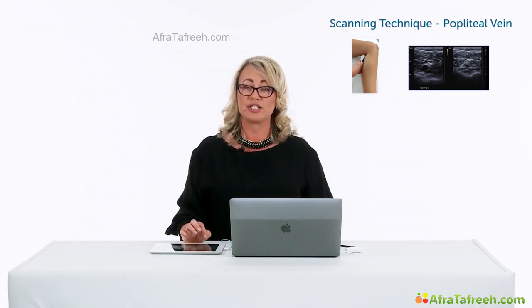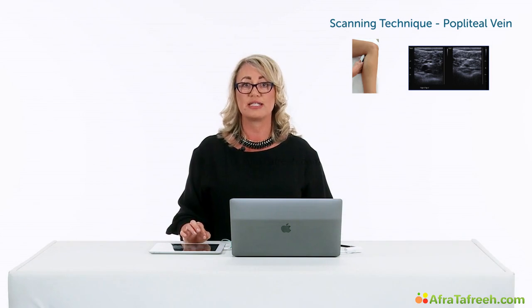You can slide back to the knee crease then and continue compressing the popliteal vein caudally until it divides into the tibio-peroneal trunk. This has now completed the above knee DVT study.